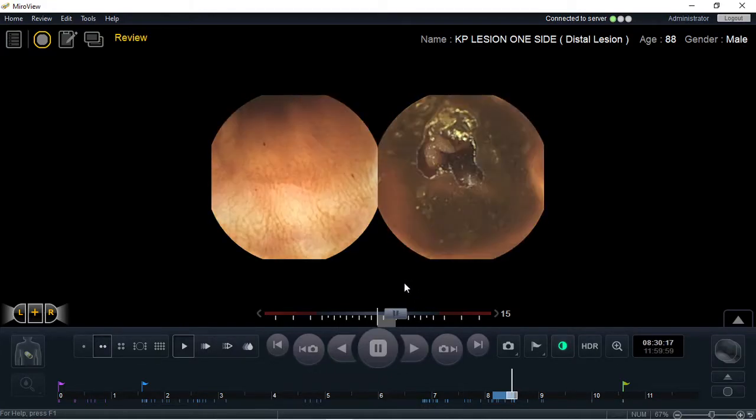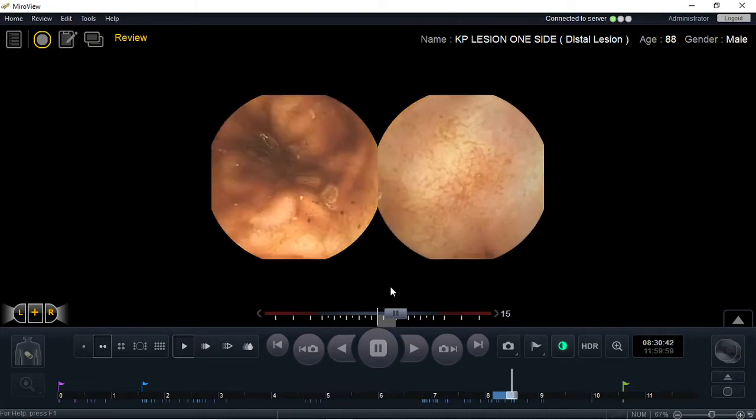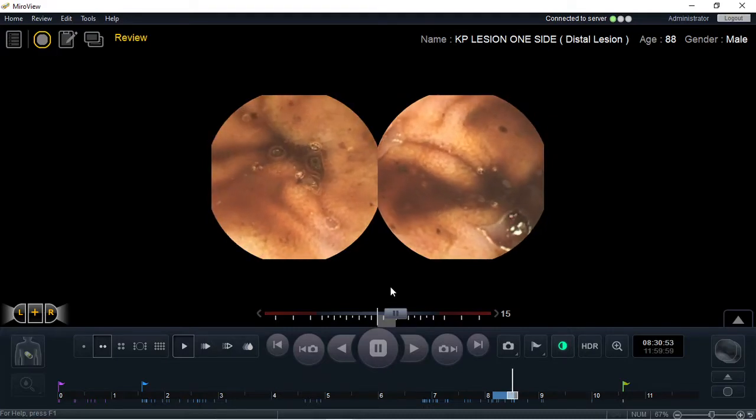The double-headed capsule minimizes that risk and in turn can increase your pick-up rate of all kinds of small bowel lesions.